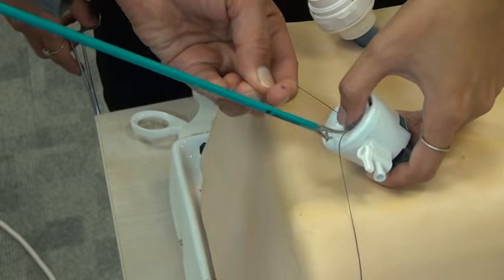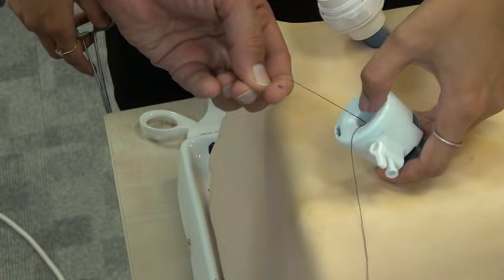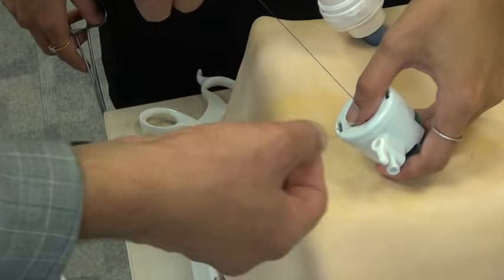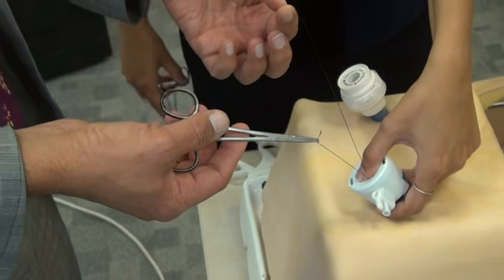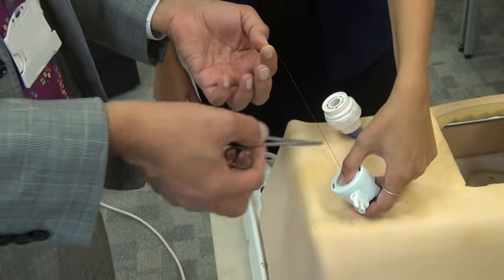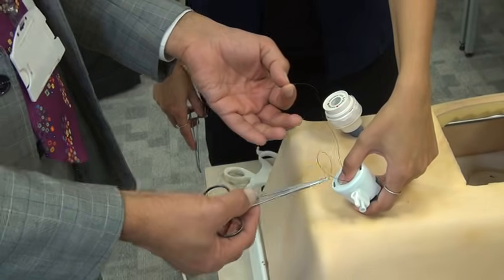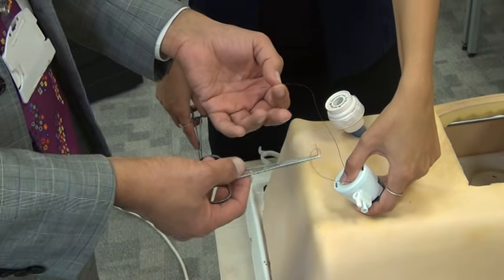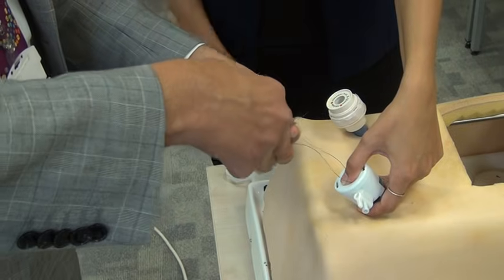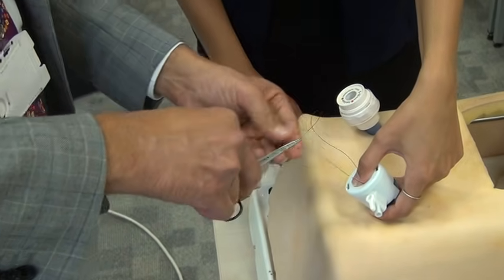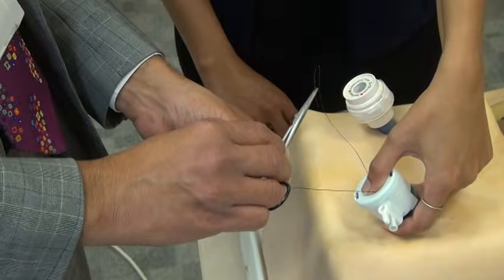Just loosen up a bit so that I can get a bit more length. So once you have decided what length you want outside, now we know this is the tail. This was the needle. We use the tail for tying the knot. So I need to just shift it to the needle end. So now I'll remind myself the clip is on the needle end.